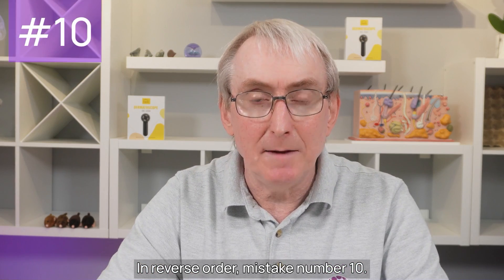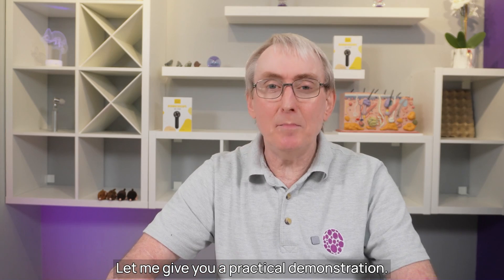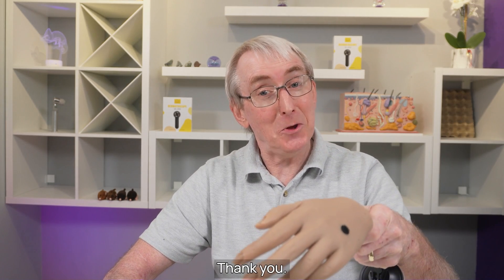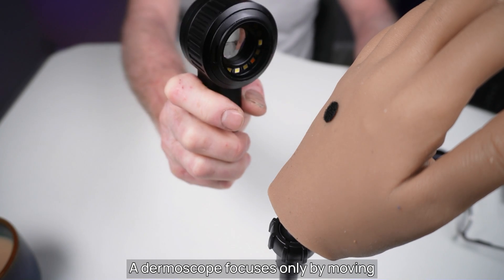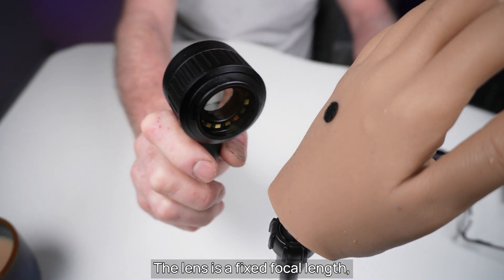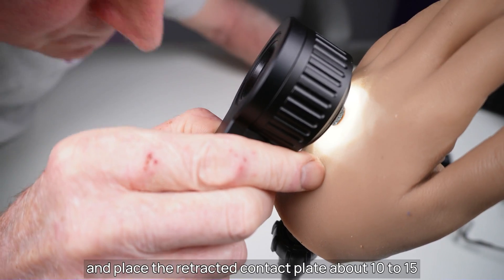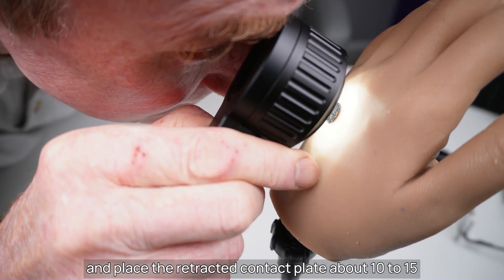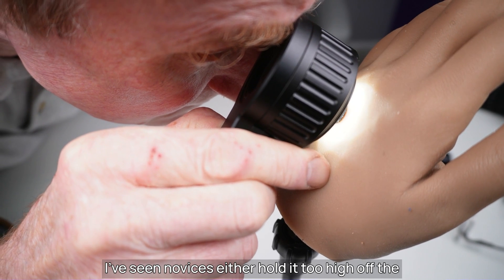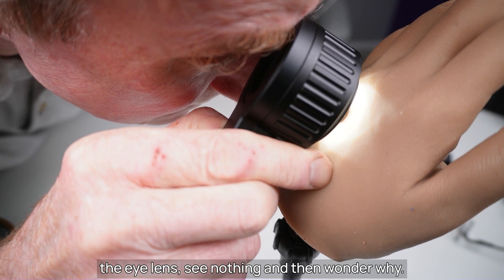In reverse order, mistake number 10: failing to understand how a dermoscope focuses. Let me give you a practical demonstration. A dermoscope focuses only by moving closer or further away from the skin. The lens is a fixed focal length one, just like a magnifying glass. Switch your dermoscope on to its polarised light setting and place the retracted contact plate about 10 to 15 millimetres above the skin surface, which is really very close. I've seen novices either hold it too high off the skin or fail to get their eye close enough to the eye lens — see nothing and then wonder why.